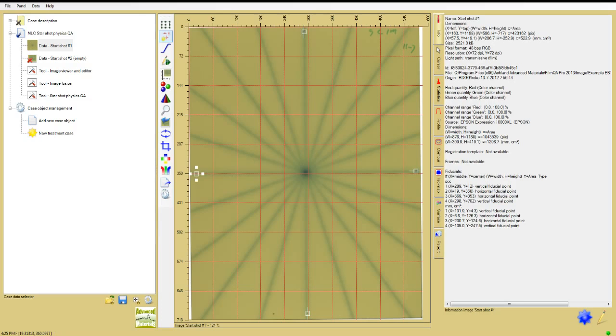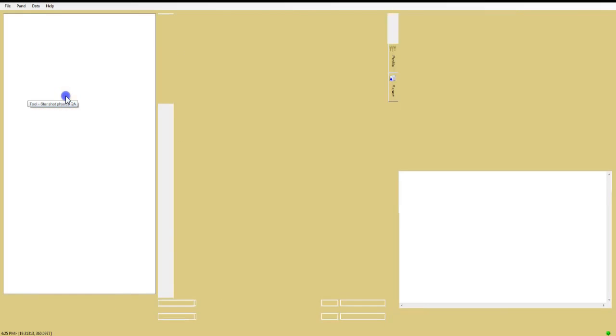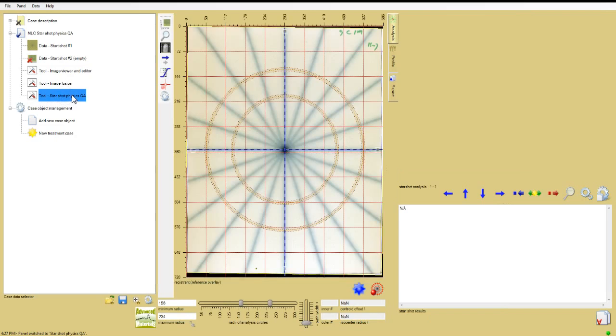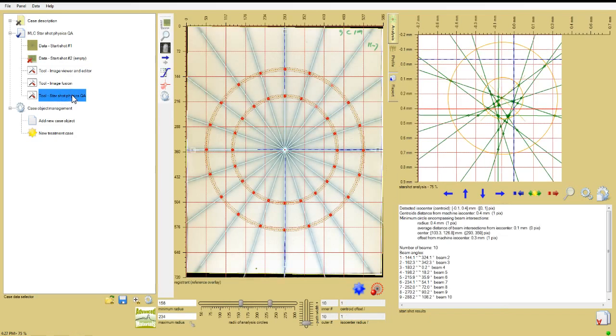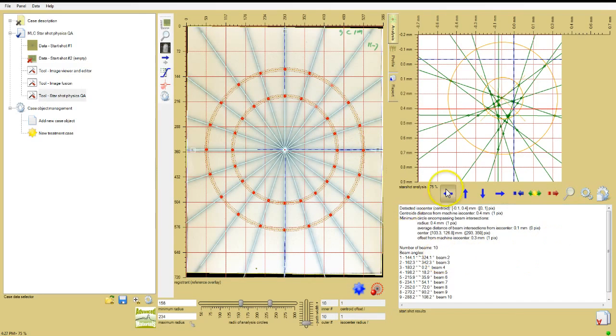With the fiducial marks highlighted, click on the line Tools, Starshot Physics QA at the bottom of the Starshot Case Object. Immediately, two circular analysis paths are added to the image window, and the results, including the smallest circle encompassing all beam intersections and the offset from isocenter, appear in the analysis tab of the analysis window.